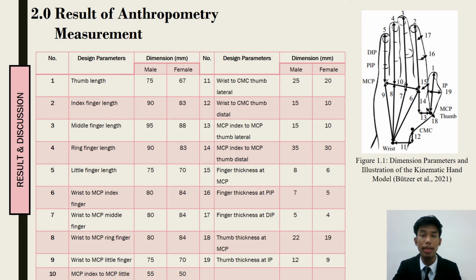The compliant finger mechanism allows for some variation in terms of hand size. However, to optimally support the user, the hand module should be tailored exactly to the user's hand size and kinematic profile. Therefore, the entire hand module is created based on a set of key dimension parameters from anthropometric measurement results. The parameters, after being measured from the user, can be fed into the SolidWorks model of the hand module.